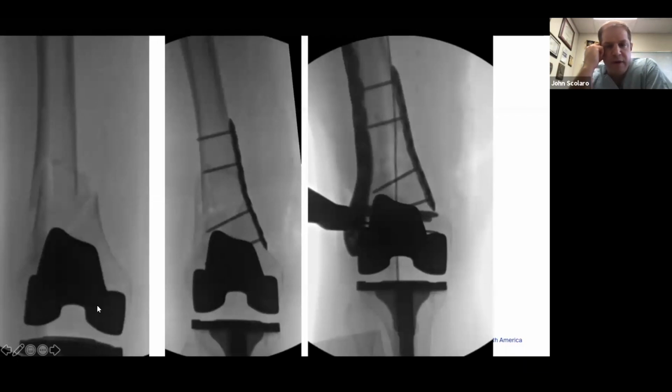We didn't talk a ton about the reduction. I think we're maybe at a little bit of higher level talk here, but you have no idea how these knees get put in, whether they're put in varus or valgus. And I really encourage people to utilize either a long guide rod, some sort of marking on their table, or a tension bovie cord in order to check alignment.